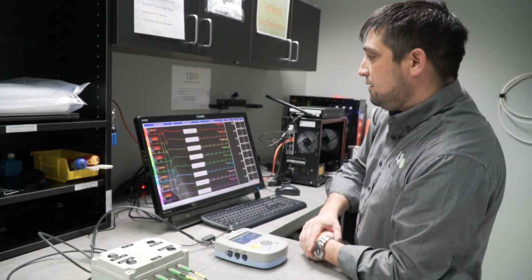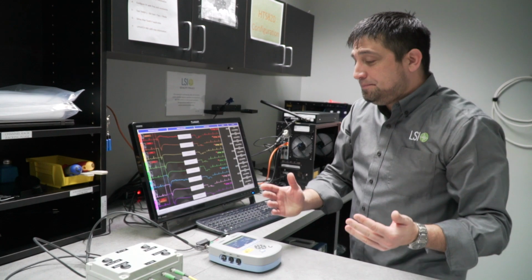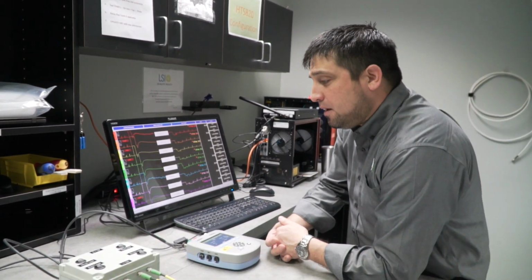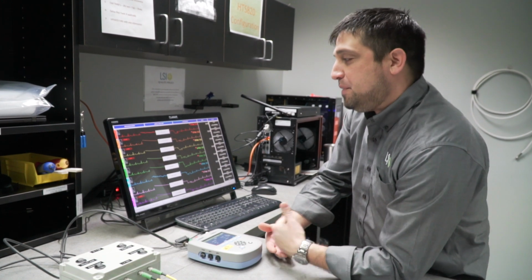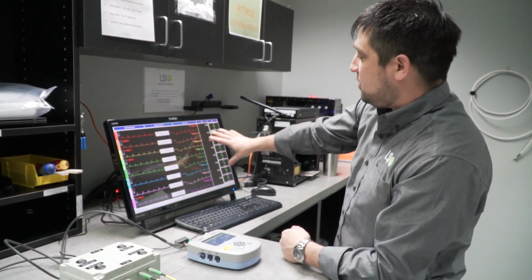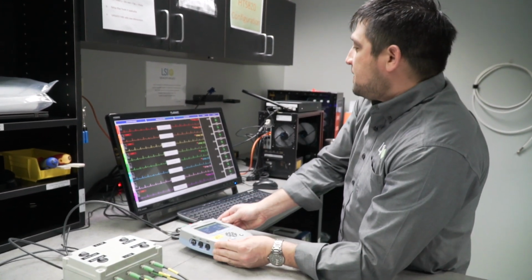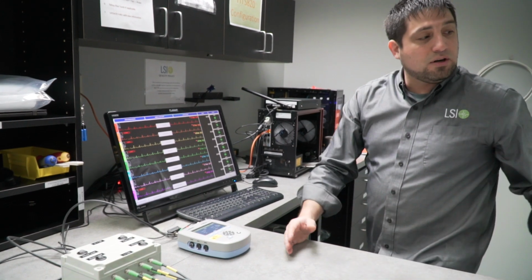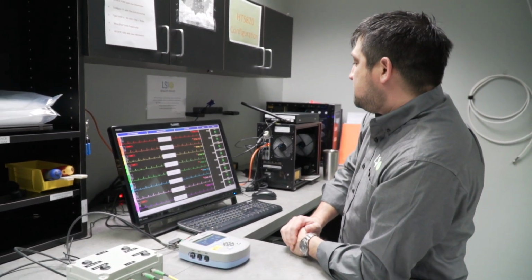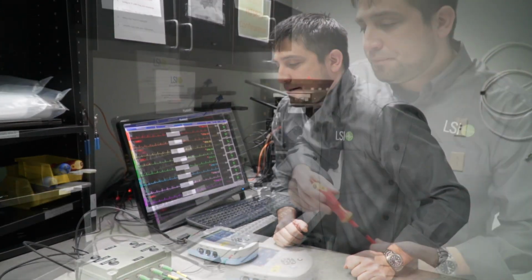and lead fault 2. So this was not originally in the scope of the project. This was added as we began our design because it just speeds up our testing process. Now, in addition to the fact that we're testing all of our transmitters at 80 beats a minute, we can also test every single one of them for that lead fault detection, which we're required to do. So that's the result of our project.